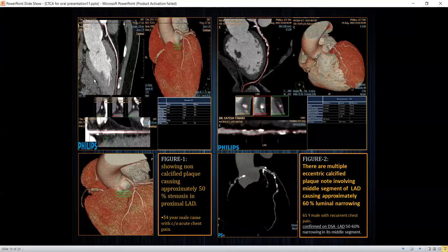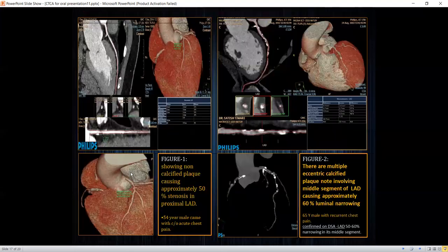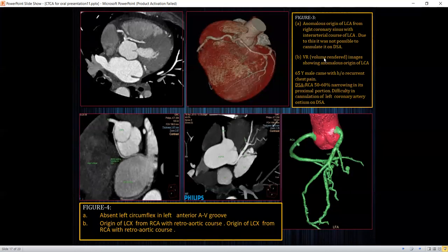Here are a few cases. The first case shows a non-calcified plaque causing approximately 50% stenosis in the proximal left anterior descending artery. In the second case, there are multiple calcified and eccentric plaques involving the middle segment of the left anterior descending artery, causing approximately 60% luminal narrowing, confirmed on invasive angiography. In the third case, there is an anomalous origin of the left coronary artery from the right cusp, coursing between the aorta and pulmonary artery — known as a malignant course.